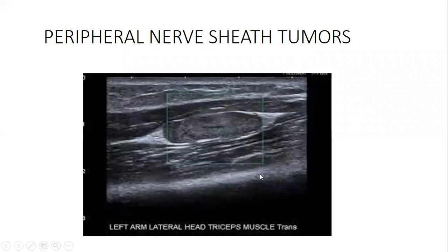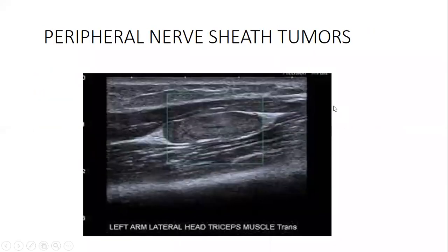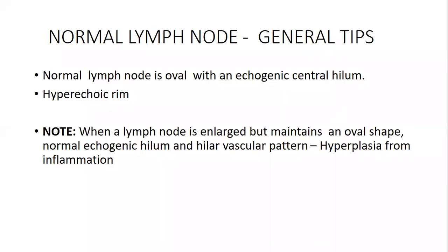These are some of the tumors again that you may find. So this was on the triceps muscle in transverse, and you can see that it's well embedded within the peripheral nerve sheath, and still you can see that there is a lesion there that is seated within the sheath.